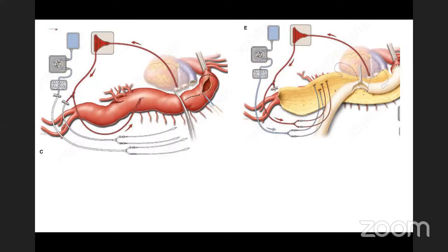And then whenever you finish the anastomosis, you just connect and give some cool blood to those vessels, sequentially perfusing them. Okay, it still does have a role in the big thoracoabdominal surgeries.